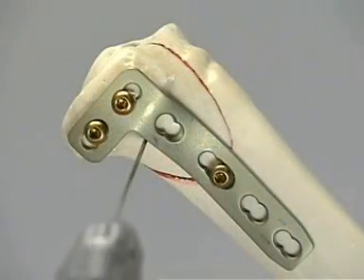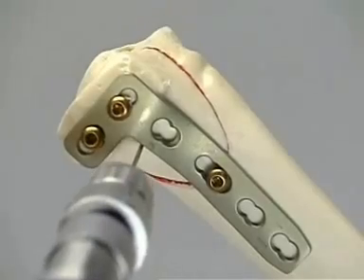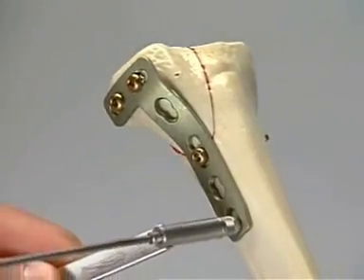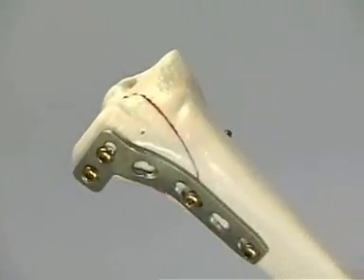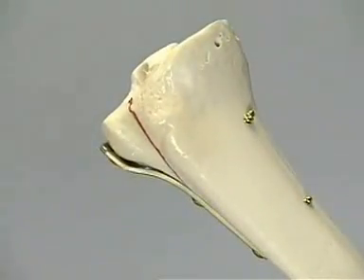The K-wires are removed. The most distal plate hole is filled with a 4.5 millimeter cortex screw. The fit of the buttress plate is snug, and compression has made the fracture line almost invisible.